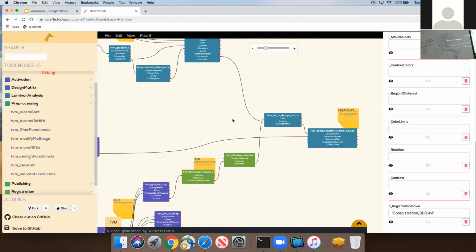But the point you made a few minutes ago was interesting. That is, you said that this framework seems to potentially be the best, I think you had said, for 0.8 millimeter voxels, in which you're trying to separate out layers. And since the cortex is about 2.5 millimeters thick, it seems that with 0.8 millimeter voxels there are, on average, about 3 voxels across the cortex.